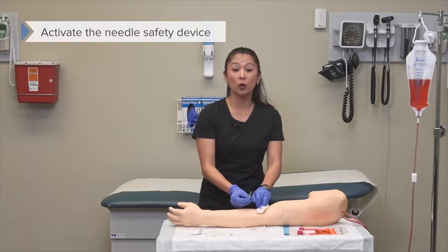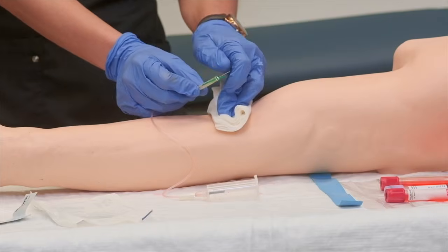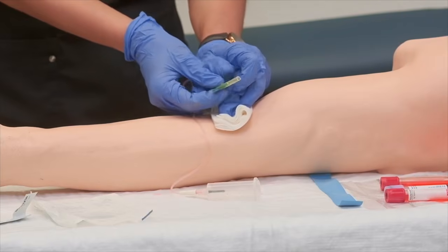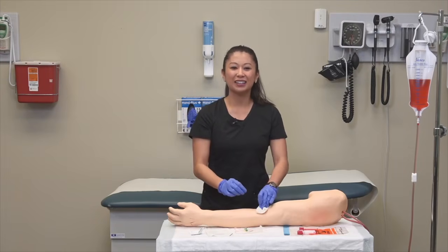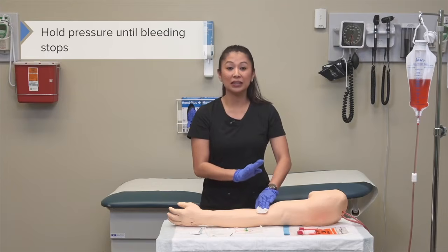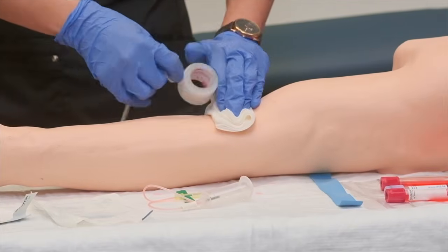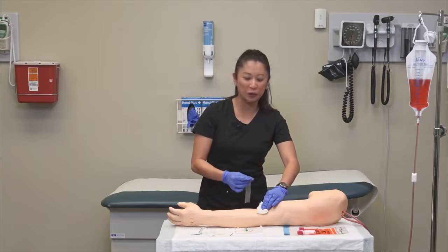Then it's really important to activate the safety device. So what I like to do here is just hold my wings and very carefully slide the yellow, which is the safety device, over the needle until it clicks. So now I'm going to put this to the side. So once I've done this, I'm holding pressure. Once we've decided the bleeding stops, it's a good idea to go ahead and tape this down. And if your patient has another hand, they can help you here as well.